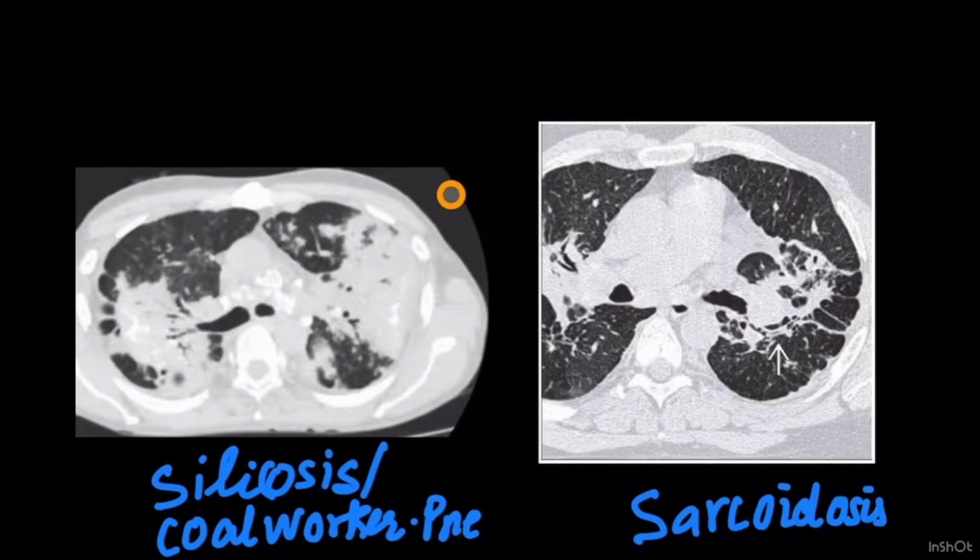Bismillahirrahmanirrahim. Here I am going to tell you the basic difference between silicosis, coal worker pneumoconiosis and sarcoidosis.